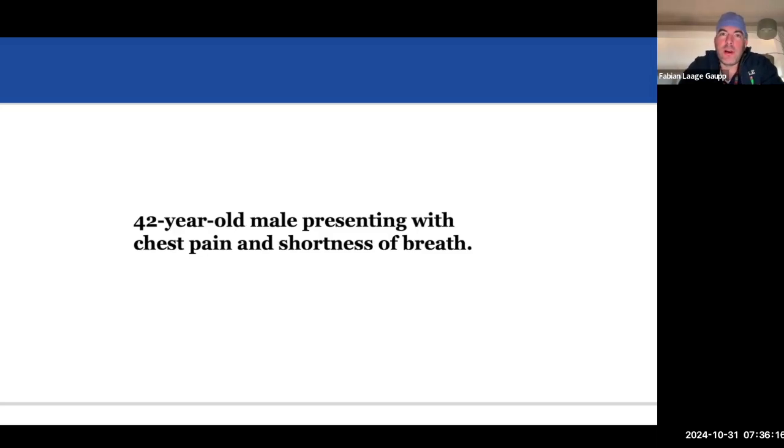So typically, first of all, when it's postpartum hemorrhage, it's usually an emergency, right? They're really bleeding out. They sometimes can already have coagulopathy, they can have DIC, and they're just bleeding. So in those cases, you want to use gelfoam, because it's considered a temporary embolic agent, and it's really just about getting something in there and stopping the bleeding. So you're typically less concerned about looking at little branches.